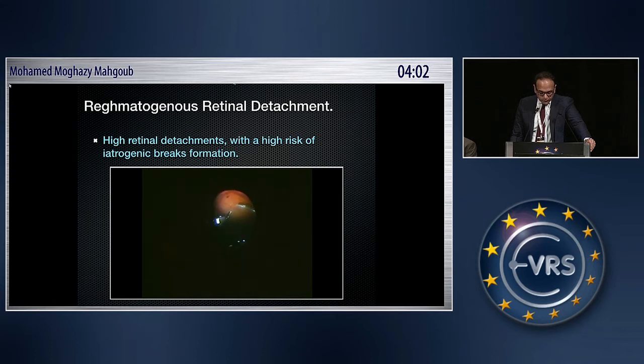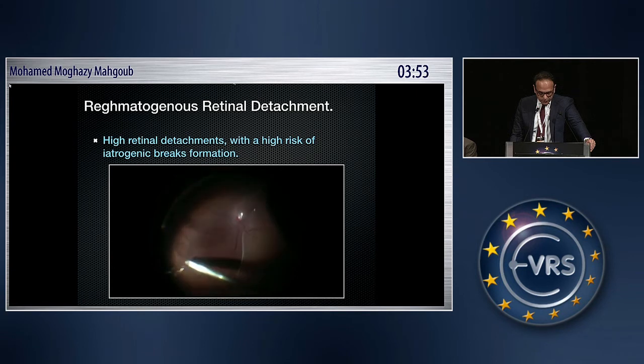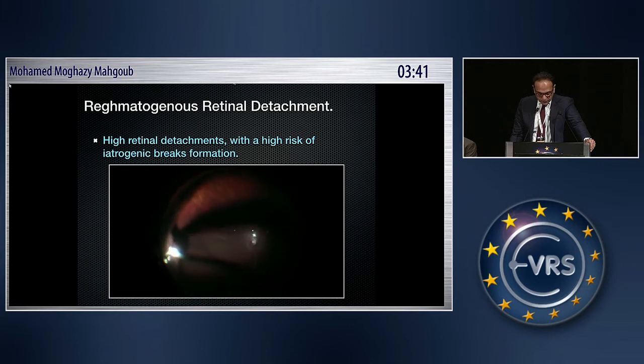You can even induce peripheral PVD under air. You can shave the vitreous in several layers safely while the retina is stabilized by the air and pushed backwards into indentation. You can also pull on the posterior hyaloid peripherally, again safely, and then take it out altogether.